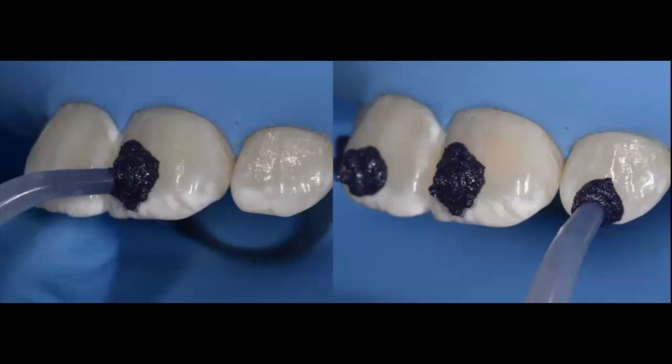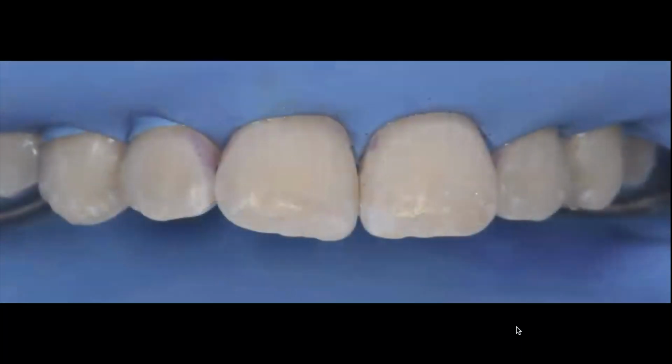This treatment is done with no anesthetic, so it's only rubber dam isolation, and then directly we apply approximately a 2 millimeter circumference of the product on each tooth. And then once it's applied, we're going to use that opal cup, which is again a cup that has very stiff bristles inside, which helps you with some mechanical removal of that superficial enamel layer at the same time that you're trying to accomplish the chemical removal of the enamel in the ranges that I already shared with you.